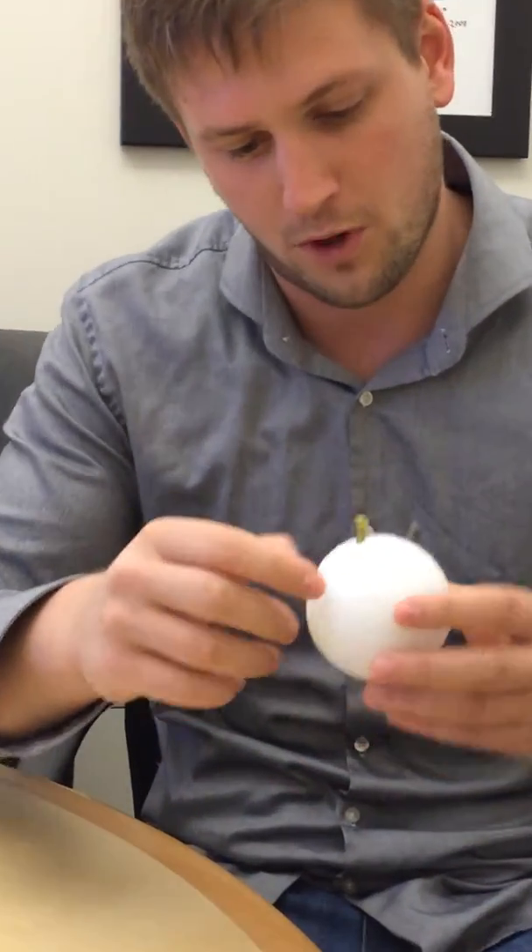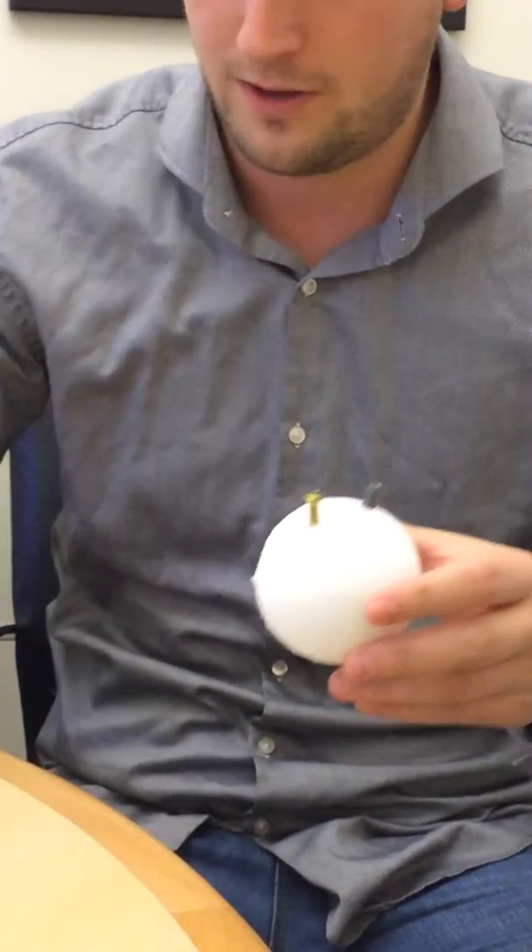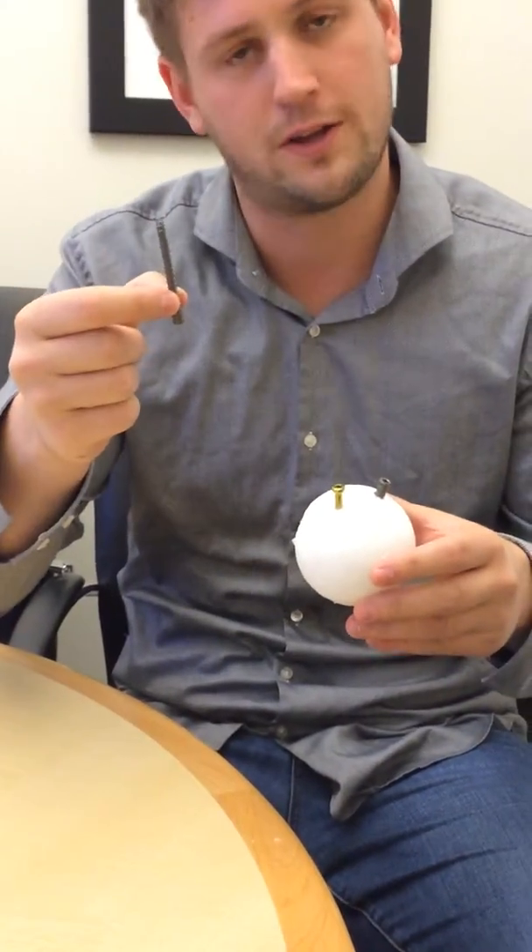This is a styrofoam ball right here — just scrape this stuff right off. We put one lag screw in and one large Acutrak 2 seven five screw.